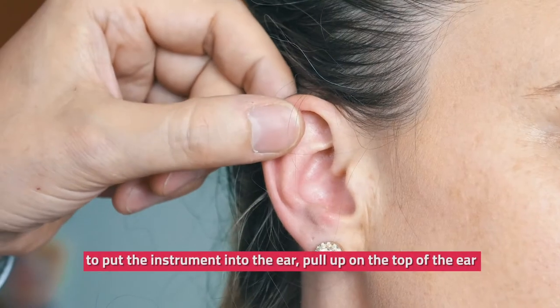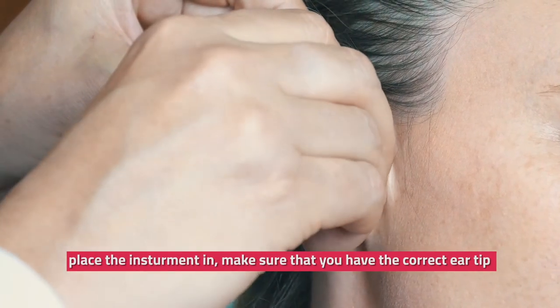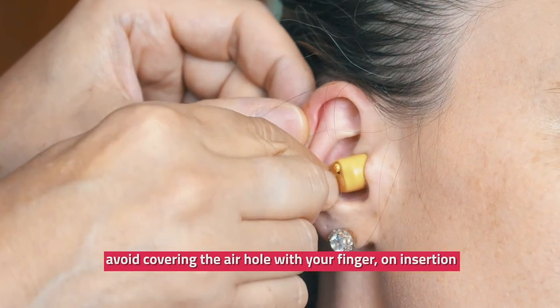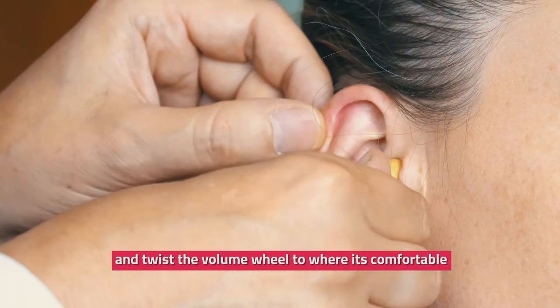To put the instrument into the ear, pull up on the top of the ear and place the instrument in. Make sure that you have the correct ear tip for your ear size and ensure the ear tip is on tightly. Avoid covering the air hole with your finger on insertion, then slide the switch to number one and twist the volume wheel to where it's comfortable.